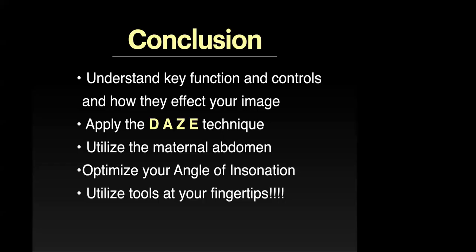And also utilize the tools at your fingertips. We have all these ultrasound machines. Learn how to utilize them. Talk to your rep, ask them what other helpful tips there are, and really learning how to do those will help you improve, and that is your key to screening.